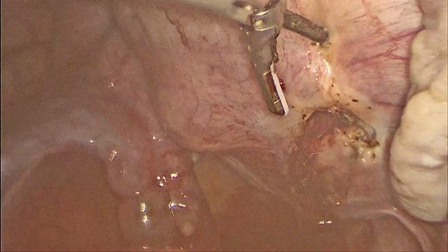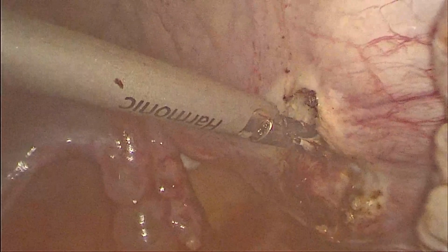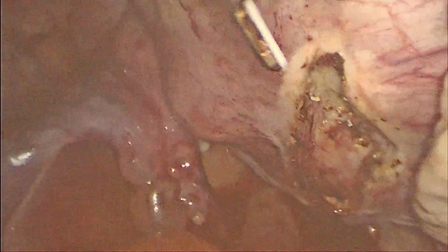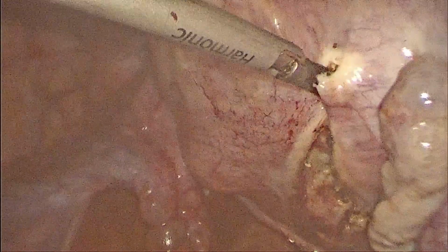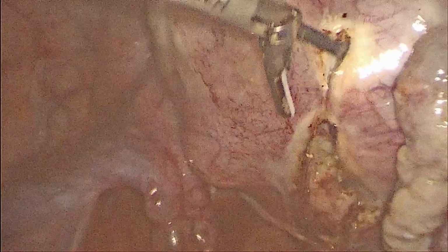As there are multiple fibroids, we try to take out as many fibroids as possible in a single incision, and the anterior fibroids were taken with a separate incision. There was a worry because of the previous myomectomy. There could have been significant adhesions, but to our surprise, it was clean.